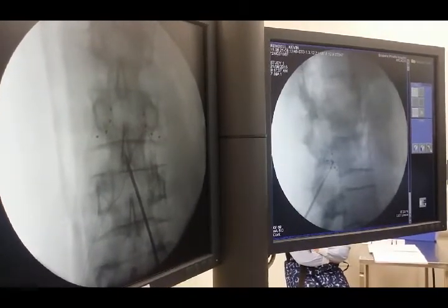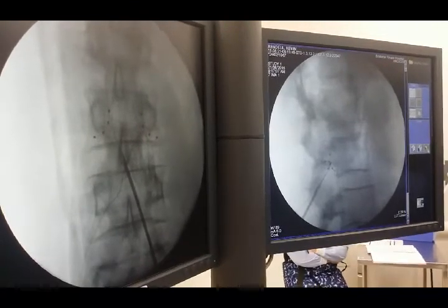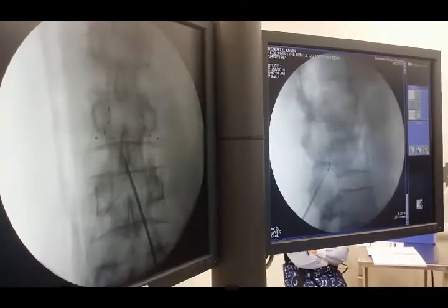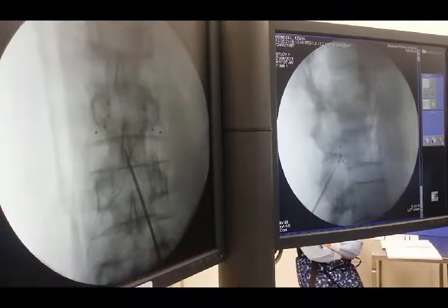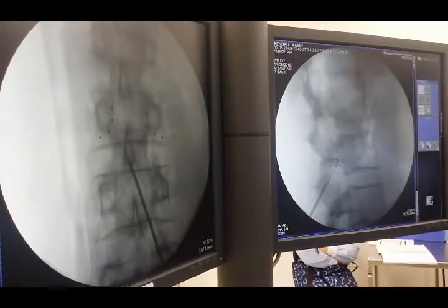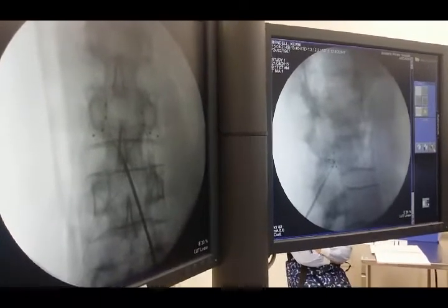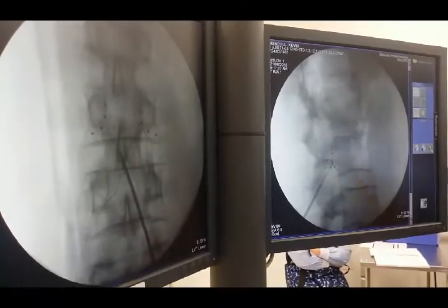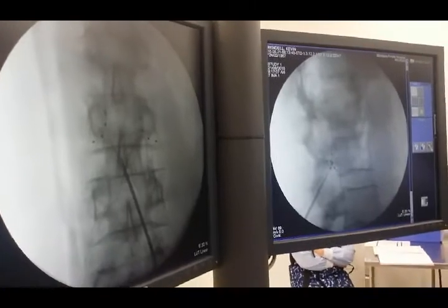It's down - she's coming right back. Maybe it's not going to make it down with one on this side. Is that low enough on the right? Have we got enough contacts to do the job? We've got those two but it has come back a little bit more than I wanted. Just a millimeter behind yellow - that's where they are, it's fine. I'm just wondering if it's going to pop back in - we haven't got this nice S-curve like the other one.